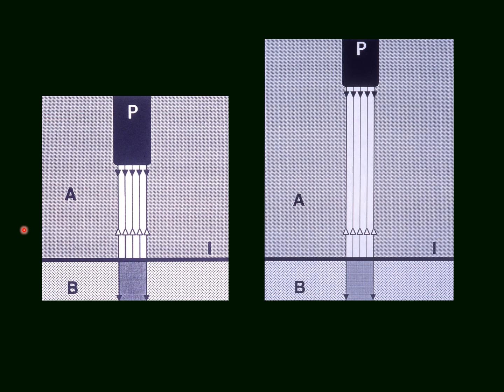When we aim a perpendicular beam at a large smooth interface, then we get a maximum echo signal. Unless there is absorption in this medium, it's still the same maximum signal when the probe is removed further from this interface.